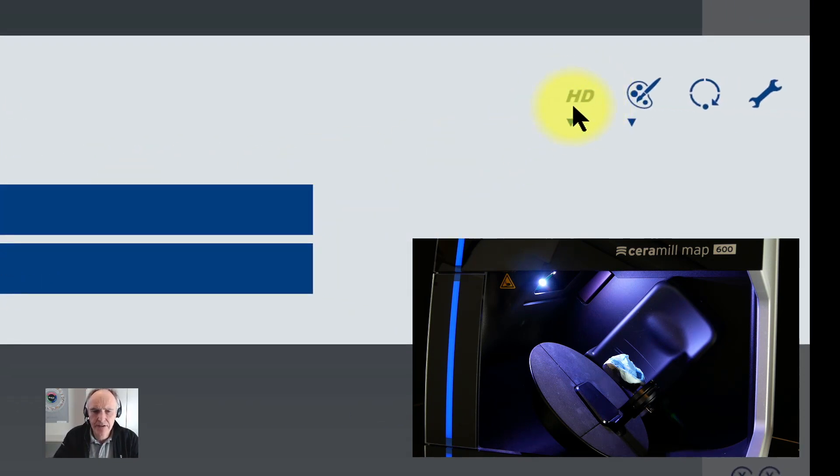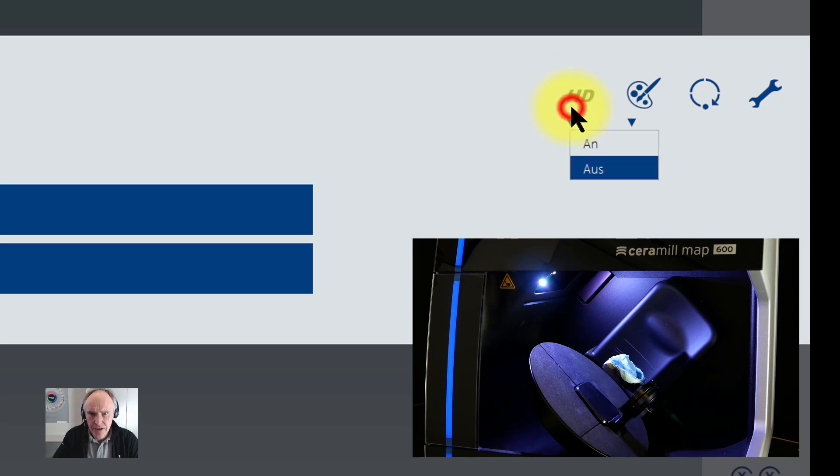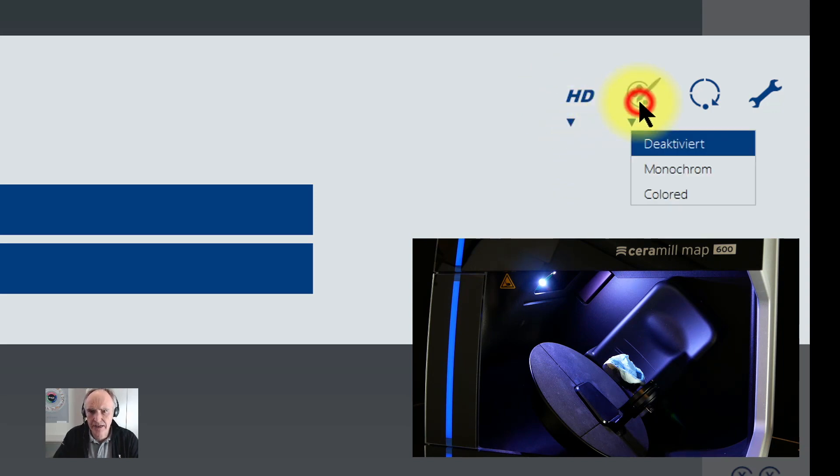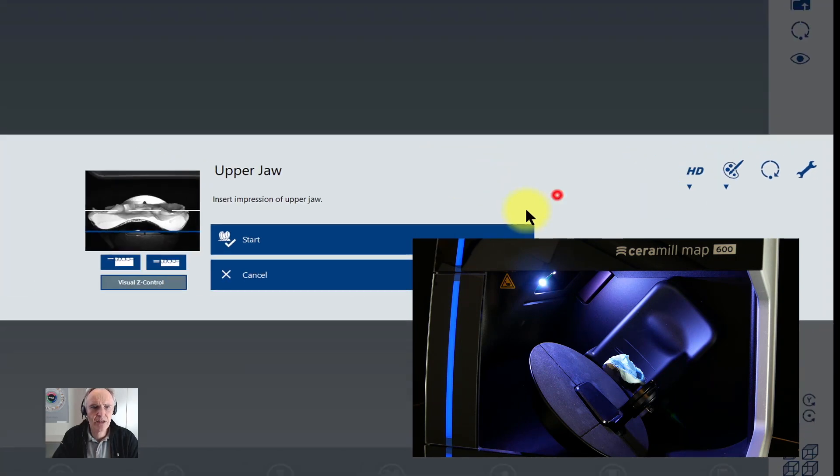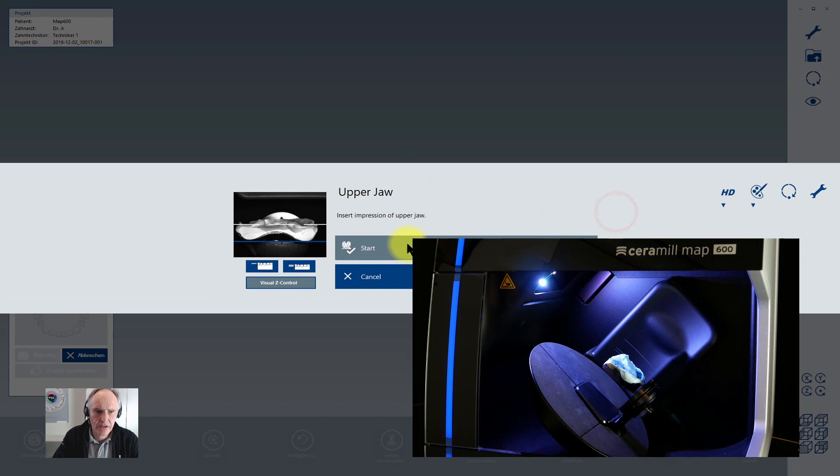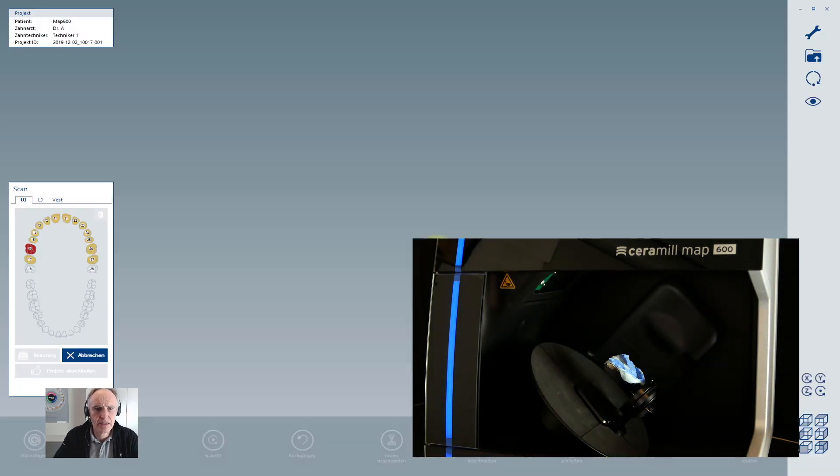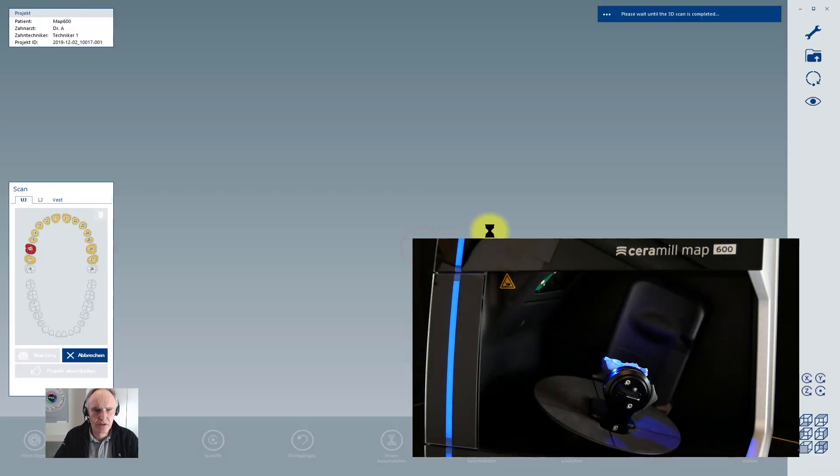Another feature is that you can select for every scan the HD, the high definition, to click on yes or no, or the color scan you can activate or deactivate. You can make a color or monochrome scan, and after that you start your scanning process.